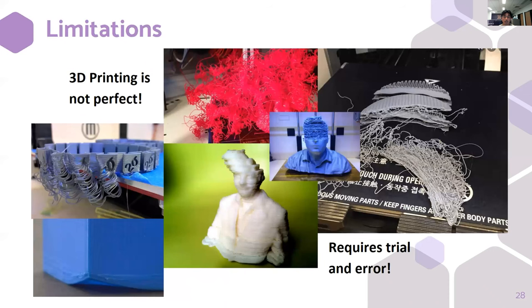Despite this, 3D printing is not always sunshine and rainbows. There are inherent uncertainties from the 3D printing process, and these uncertainties further vary by different manufacturers of 3D printers and materials. So it's true that radiotherapy centers can acquire and use 3D printing, but it requires a level of 3D printing expertise, proper quality assurance and control for 3D printing machines and materials prior to conducting research and clinical work.